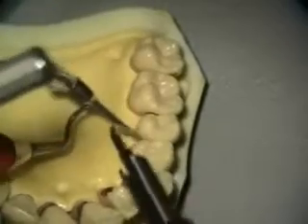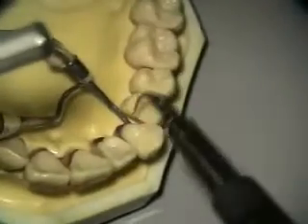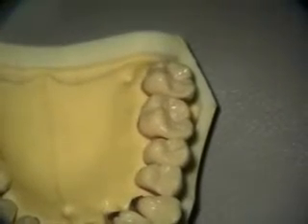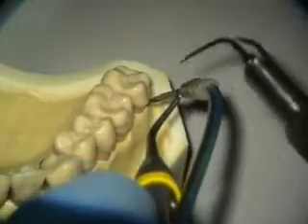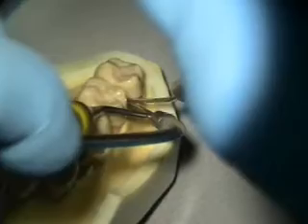A lot of times you don't have to cross-instrument here. Every once in a while, if you feel like you need to look at it a different way, then you do that. Those of you who are watching this video and getting into this, you are definitely looking at it a different way. So I switch to the left explorer. If I need to reangle this, I just hold on to the insert and turn the handle. Get to the distal buccal — sometimes you have to push the cheek out. Cleaning here, into the furcation, and sometimes you have to angle up and into the mesial.